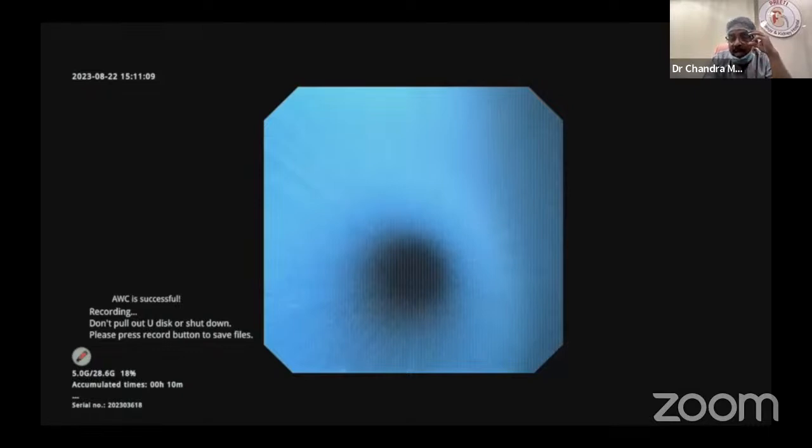Till today, I felt that the flexible nephroscope tip length is too much, so that you cannot go from one calyx to another calyx. But now newer generation flexible nephroscopes are coming. They are highly bendable. This is one case. So this flexible nephroscope will go into all calyces, how, I will show. And you can use a basket and bring the stone back to the pelvis and take the rigid scope and finish, so that prone PCNL with flexible nephroscope is a competition to ECIRS.